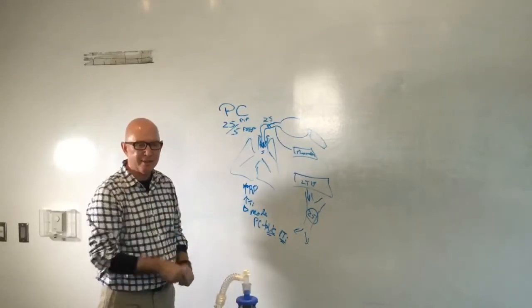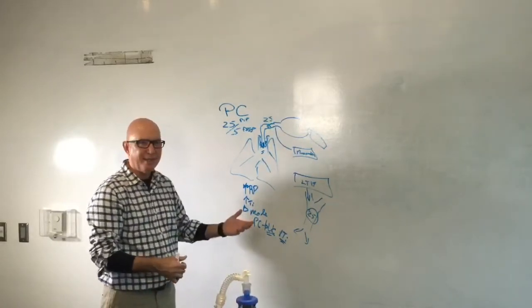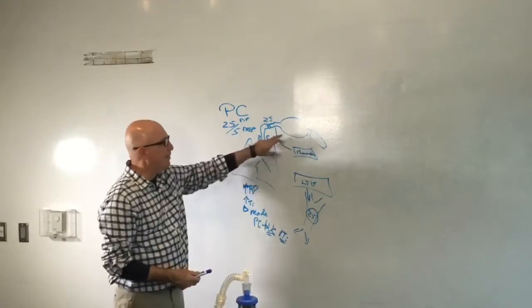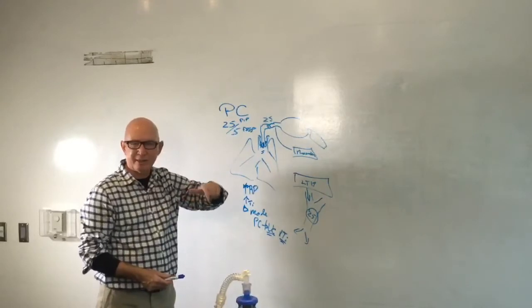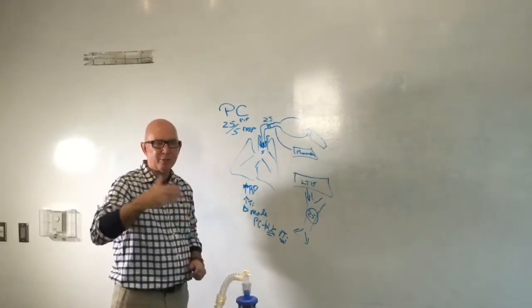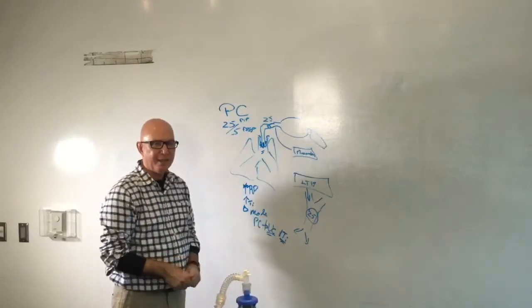But there are some strategies that you can use that I would try first before I decided I was going to bag for the transport. Because one of the dangers of the resus bags, and that's why we have the T-piece system within the context of Ornge these days, is that the T-piece will actually give you consistent pressures, breath to breath to breath, where these pressures are inconsistent when you're bagging a patient.